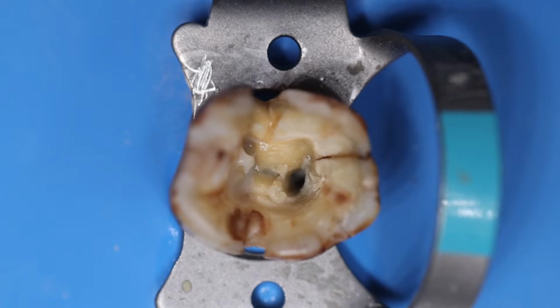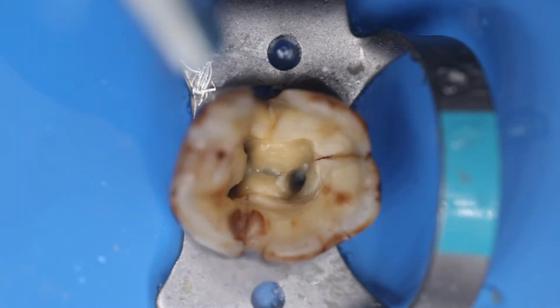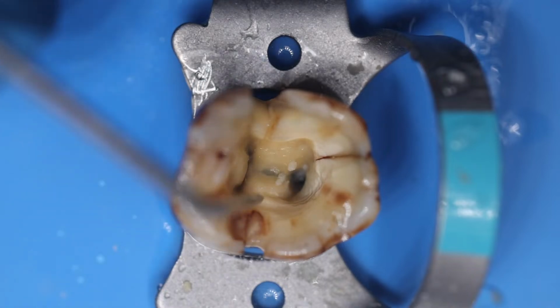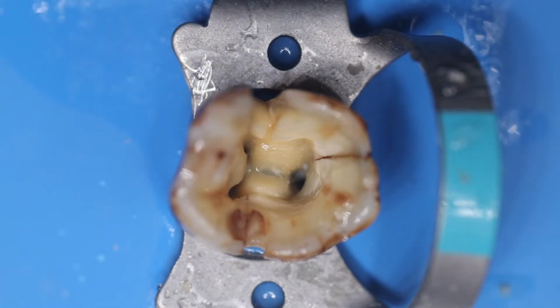Now when you have just opened the orifices, see now. So now you are into the proper axis, where you have just removed the caries over here and entered into the pulp chamber. So this was all about the access. As you can visualize over here, you have done a proper access opening. So hope you got my point, and we would be back with the biomechanical preparation.